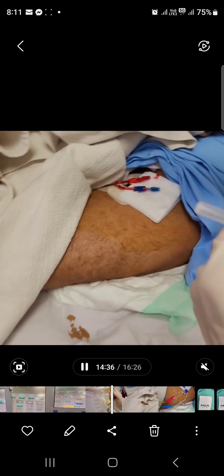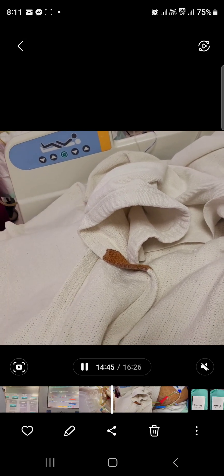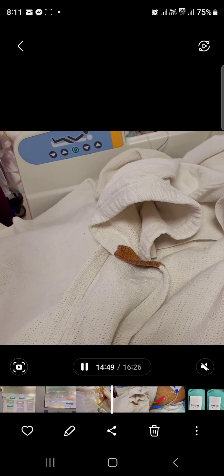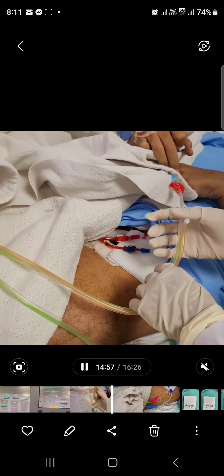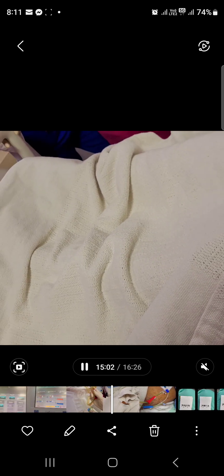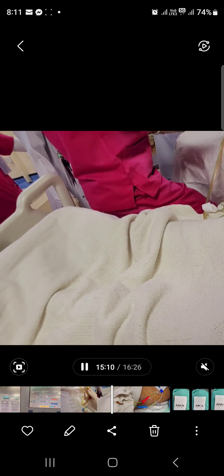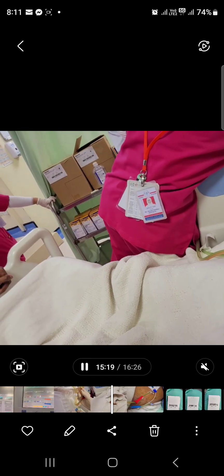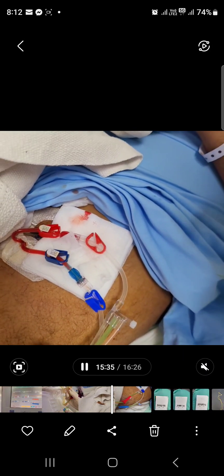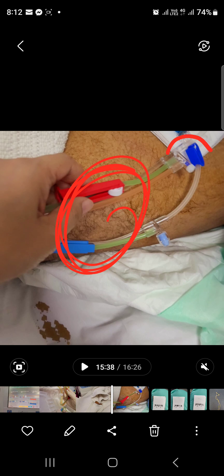Once everything is set up, prepare your IV access. Your IV access should be large bore — it is advisable to use an HD catheter, which is why we inserted a dialysis catheter for this patient. Make sure the catheter is always heparin locked. Before connecting to the patient, ensure the patency of the line. Remove the heparin from the HD catheter. Once both ports are checked and patent, connect red to red, blue to blue — keep chambers closed but clamps open, as we are ready to start treatment.